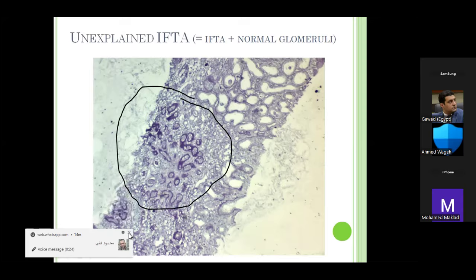We have polymorphs, no, increased mesangial matrix. Okay. No, no, this is an old message. We have now polymorph, interstitial fibrosis. Okay. And interstitial tubular atrophy. Fibrosis, yes, and tubular atrophy, yes.